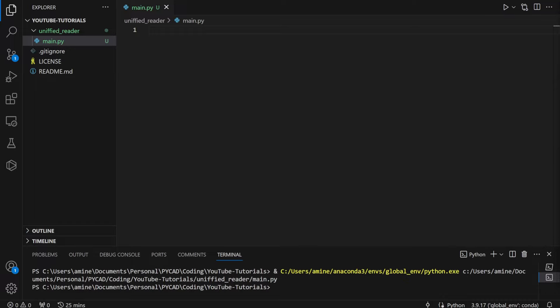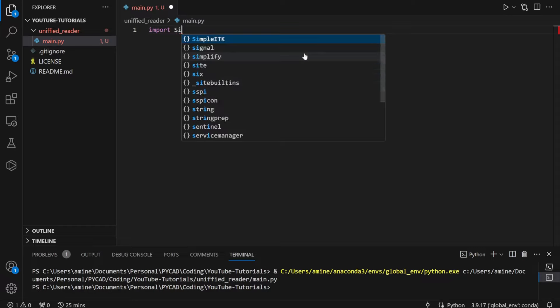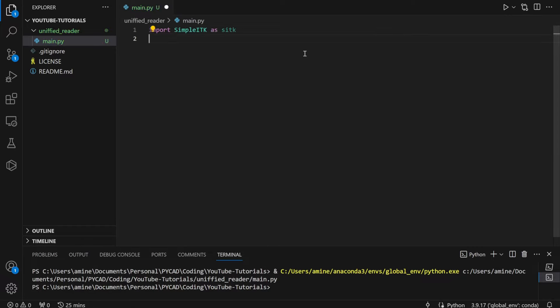So the first thing we need to do is import SimpleITK. If you don't have it already, you can install it using pip install simpleitk. Then we import it: import SimpleITK as sitk — that will make it easier to use.